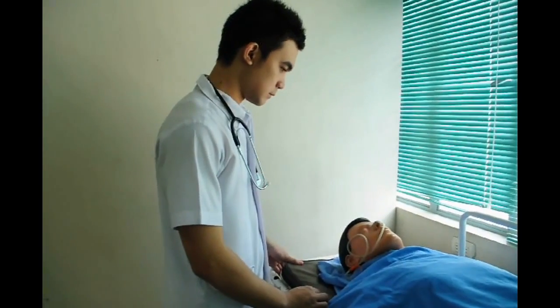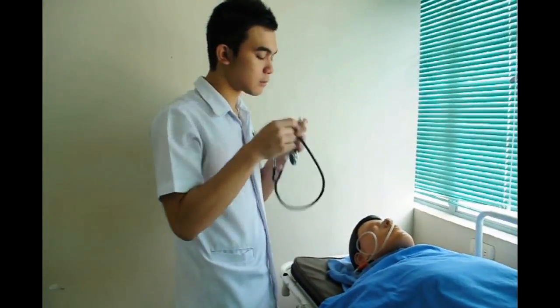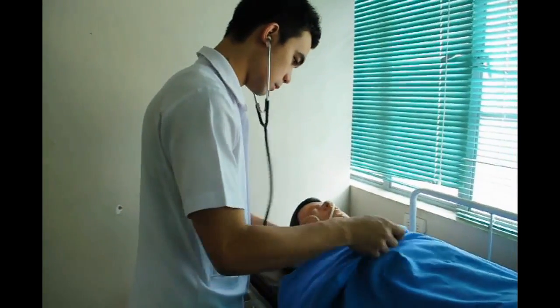Nurse Kelvin now performs abdominal quadrant assessment. This is to ascertain that the tube is in proper placement.